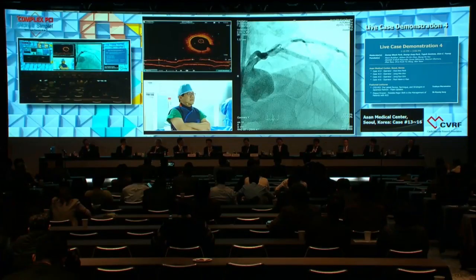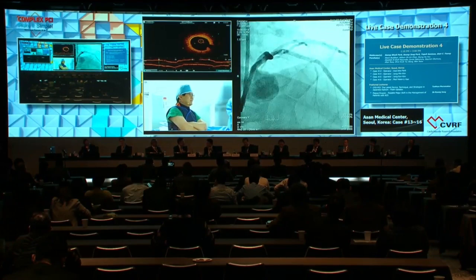And also it's a difficult treatment. What you'd do is not easy, even if you want to treat that circumflex. Anyway, just leave it alone. Is the current practice the best? In the absence of ischemia, I don't want to touch it. And we're going to study this in the PREVENT trials. There are negative-FFR vulnerable plaques over there, so we're going to compare treating versus medical treatment. That is our currently conducted study. However, in any case, an FFR of 0.9 is absolutely free of MACE. I believe that.